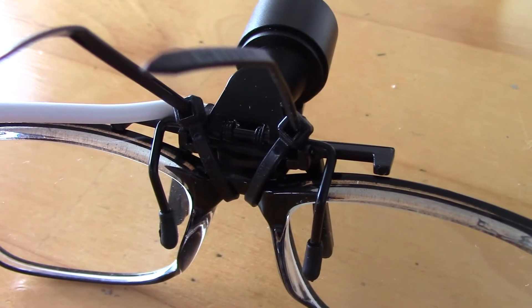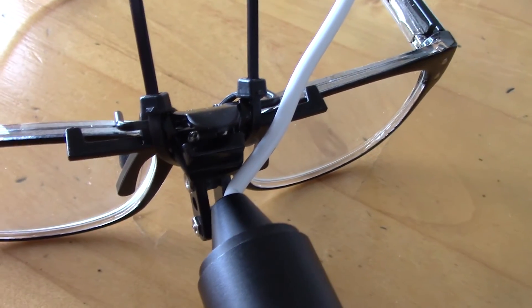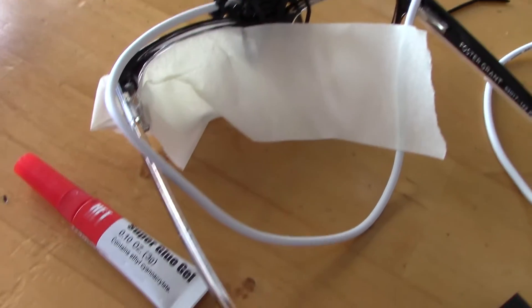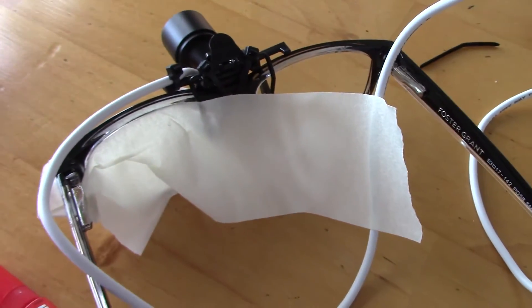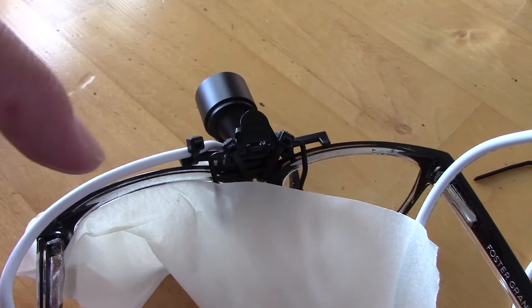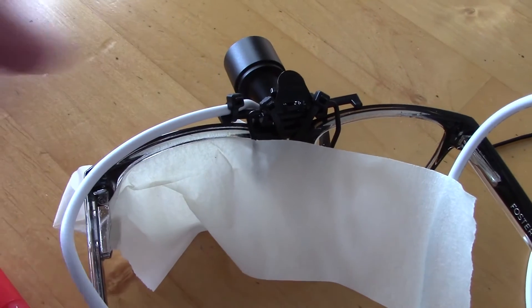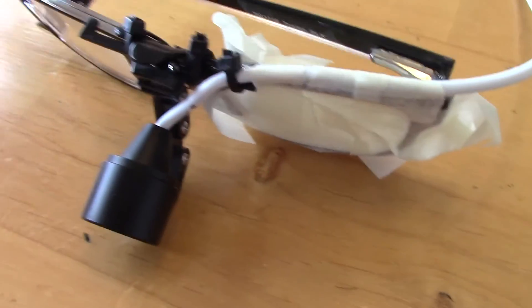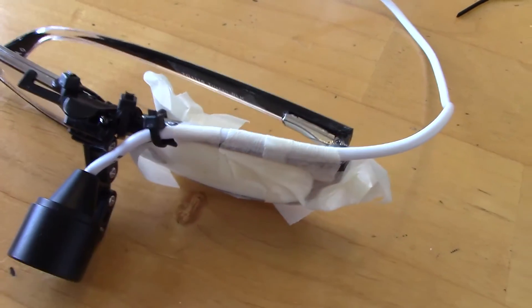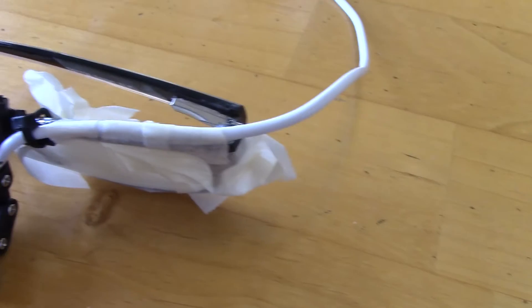Then you just snip off the excess. Next, use masking tape to tape the lens of the glass so you don't get superglue onto it. Then glue the wire to the top of the rim, add one zip tie to stabilize it, tape it down, and let it dry — it won't take too long.